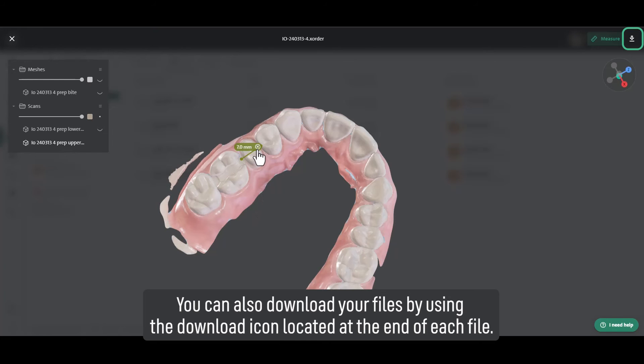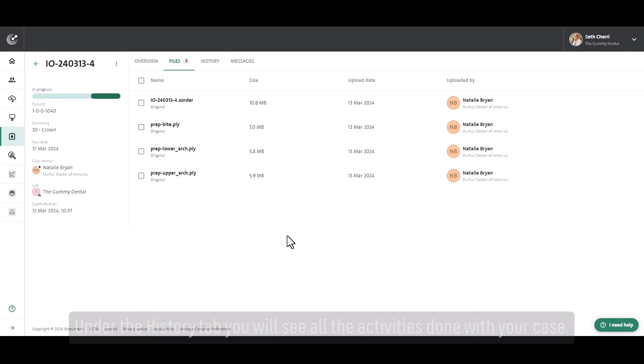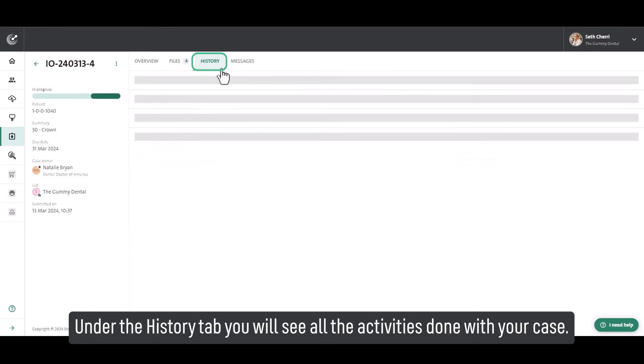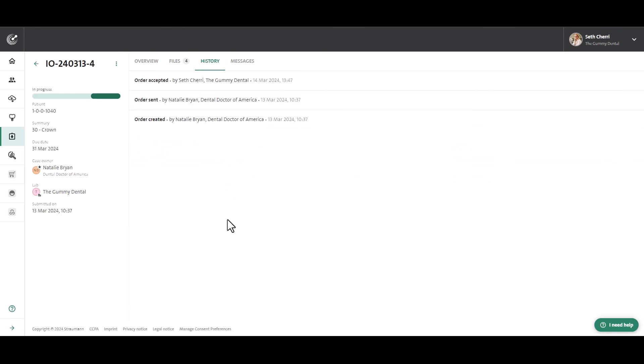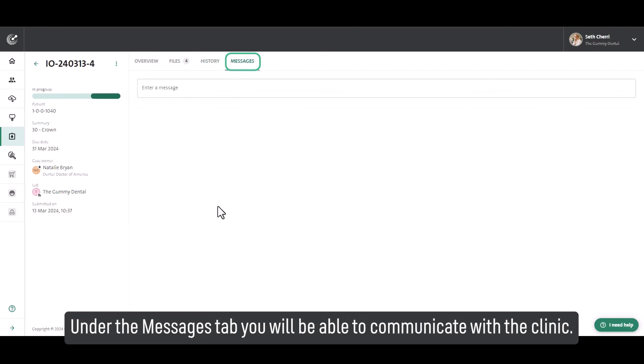The download icon is located at the end of each file. Under the History tab, you will see all the activities done with your case. Under the Messages tab, you will be able to communicate with the clinic.